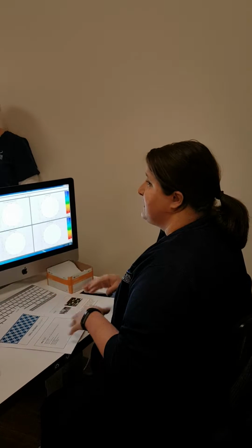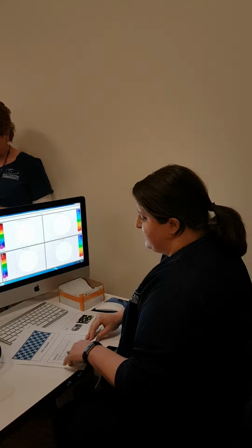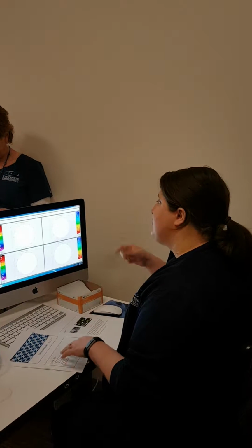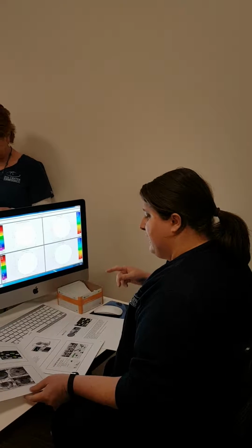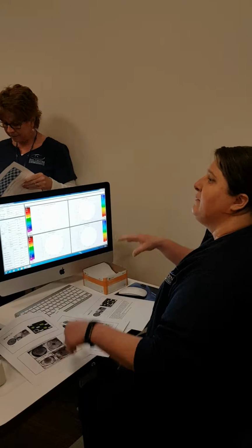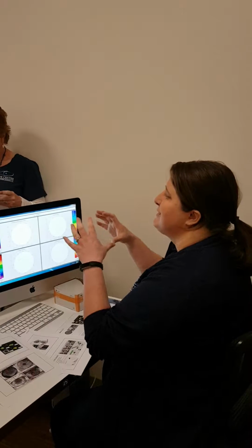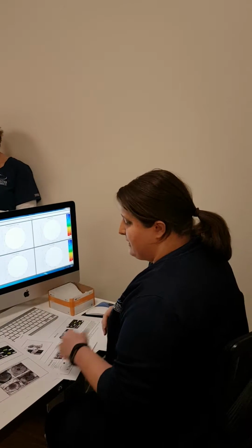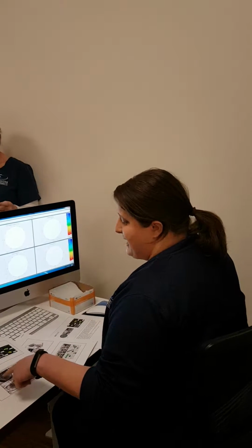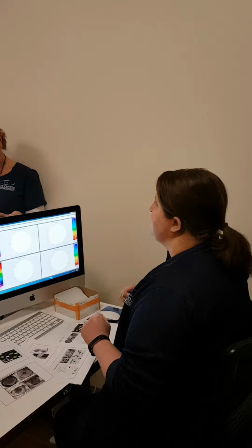Various techniques and machines are used, have been used, and are currently used. The Placido's disc type of topography uses concentric rings, and you can see a picture of it on the third page. Basically it reflects these rings off the cornea, and if the rings change shape or distances between them, we can tell there's an irregular spot. And there's some examples down below of some irregular Placido's discs. Top one is normal, where it's all concentric and even, and then just kind of gets worse from there.